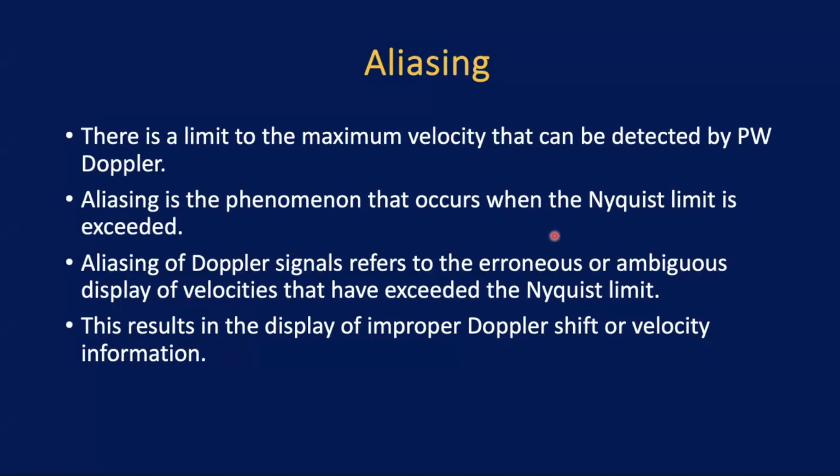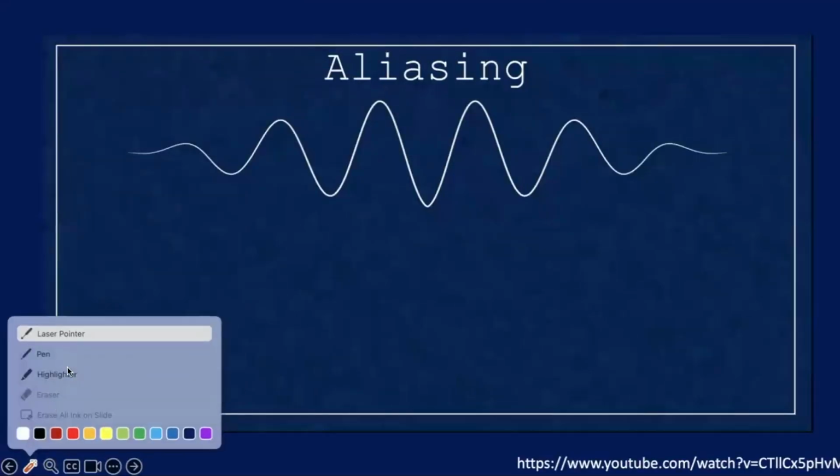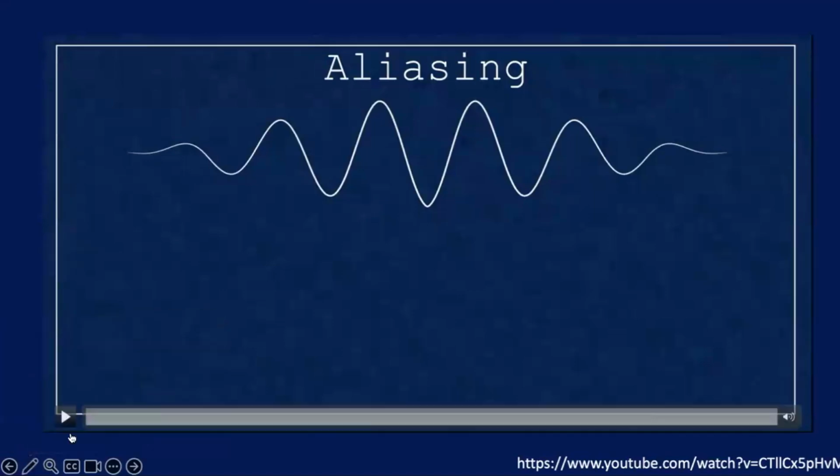It's really important. It's not bad. We think, oh, there is aliasing, does this mean something negative? No, we use it all the time. We use aliasing all the time in measuring the valves, in knowing there is stenosis, there is SAM, there is a mid-cavity gradient. It's really important. And I found this video really nice to explain the aliasing.